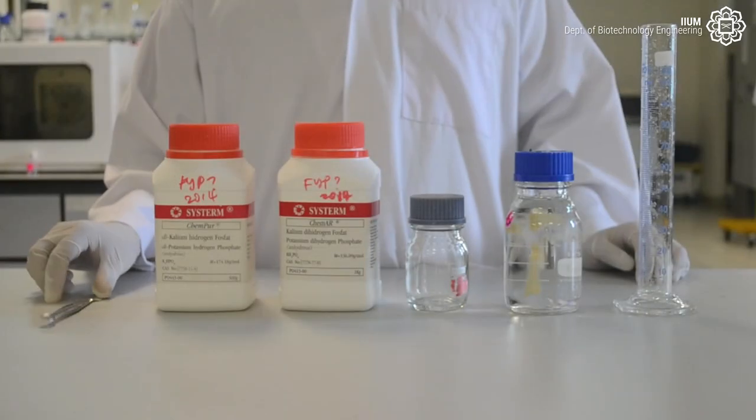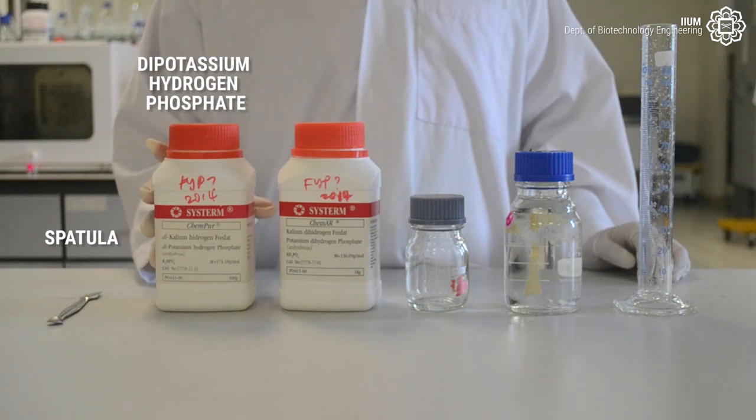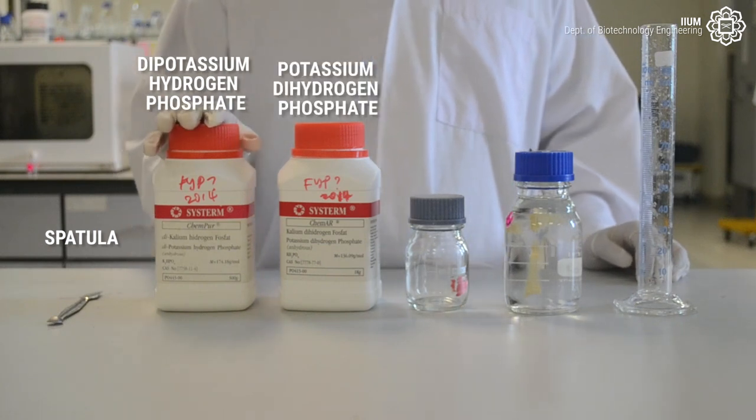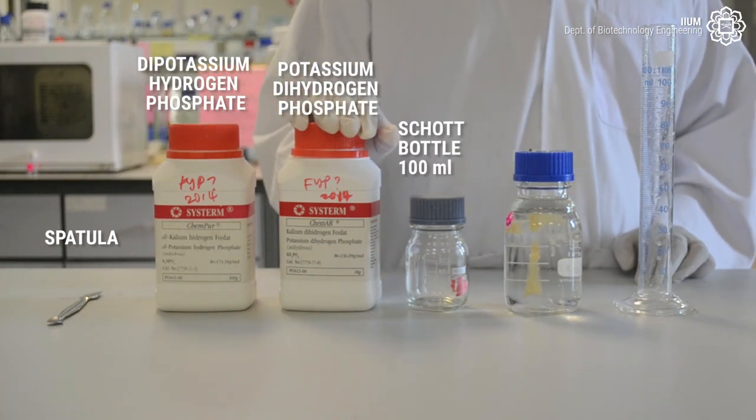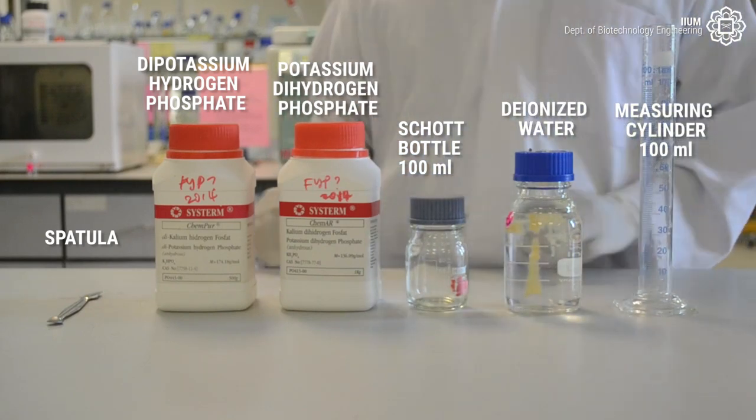To prepare phosphate buffer, we need a spatula, dipotassium hydrogen phosphate, potassium dihydrogen phosphate, a 100ml shot bottle, deionized water, and a 100ml measuring cylinder.